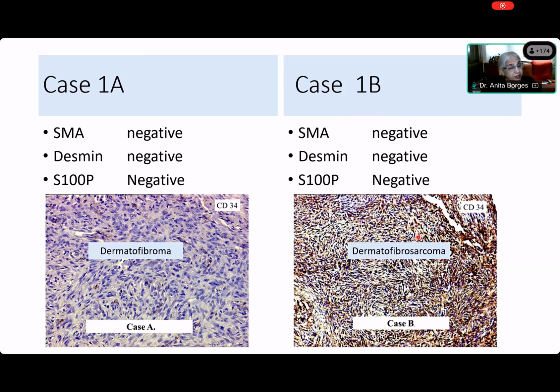All right. So this is something that I would not hazard a guess on when we have a lesion in the skin. This is one area in which I would suggest that, even if you don't do SMA, desmin, and S100 protein, you do a CD34. And if that CD34 is positive, it is a dermatofibrosarcoma, if it has, of course, a storiform appearance and it is in the skin. Now, that's a message that I hope you have got across.